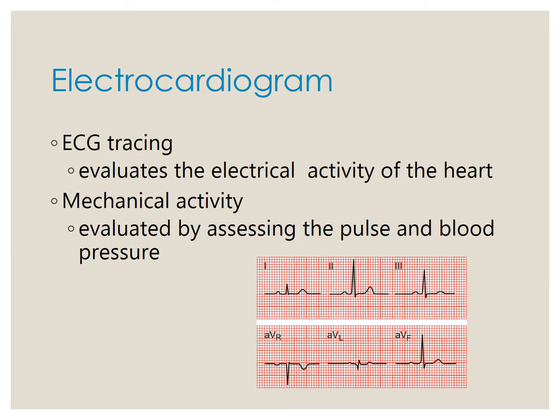Okay, this here is an electrocardiogram. It's ECG tracing, or lots of people refer to it as EKG tracing. They just mean the same thing. So this ECG tracing is designed to give a graphic display of the electrical activity in the heart. The ECG cannot tell you about the mechanical activity of the heart. To assess the mechanical activity of a heart, you must assess the patient's blood pressure and pulse.